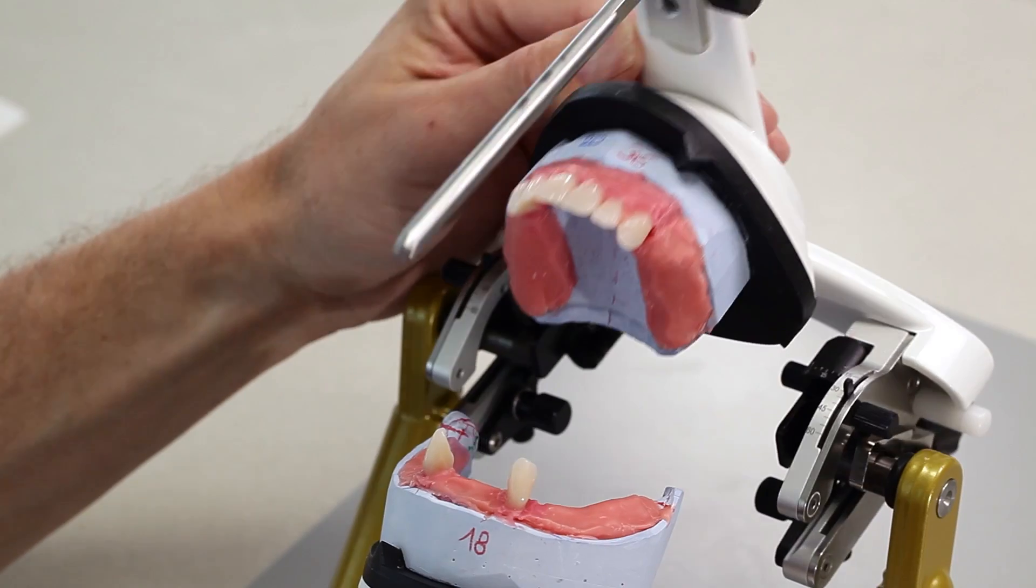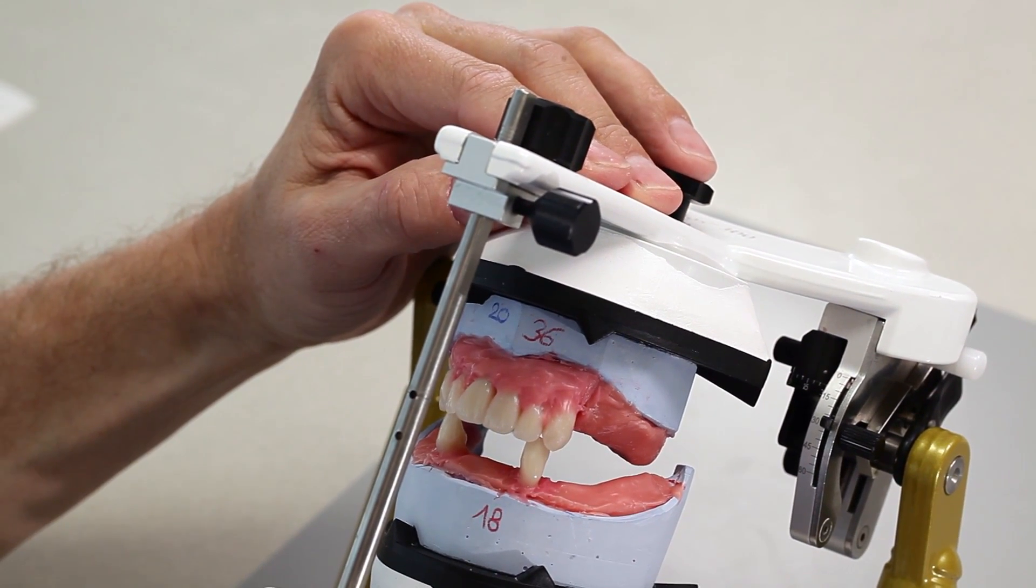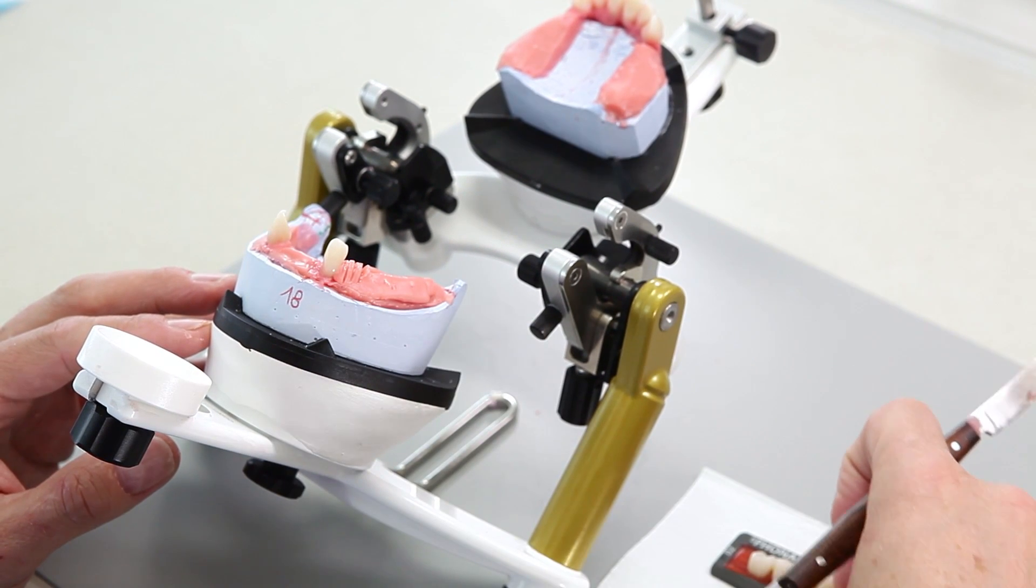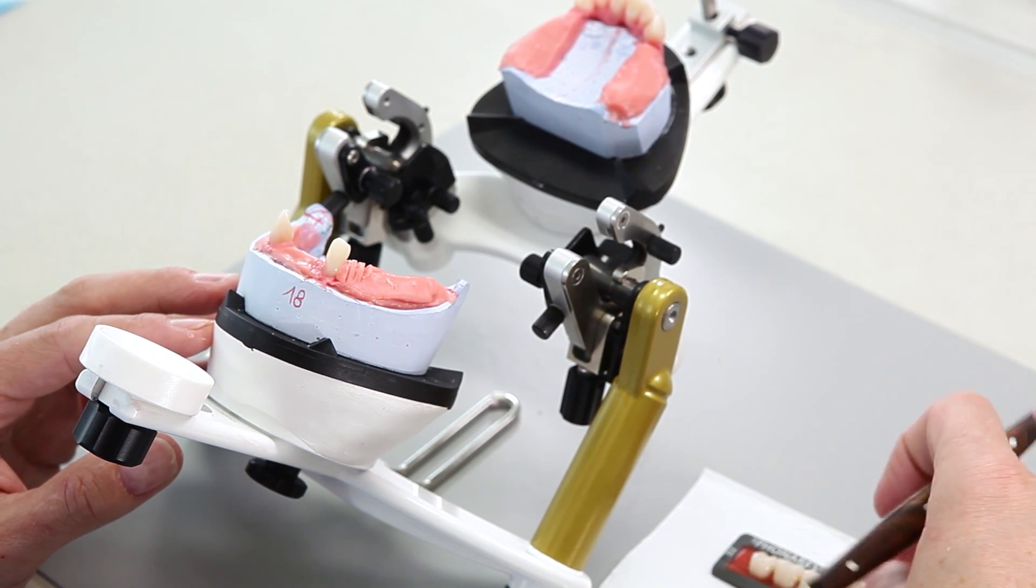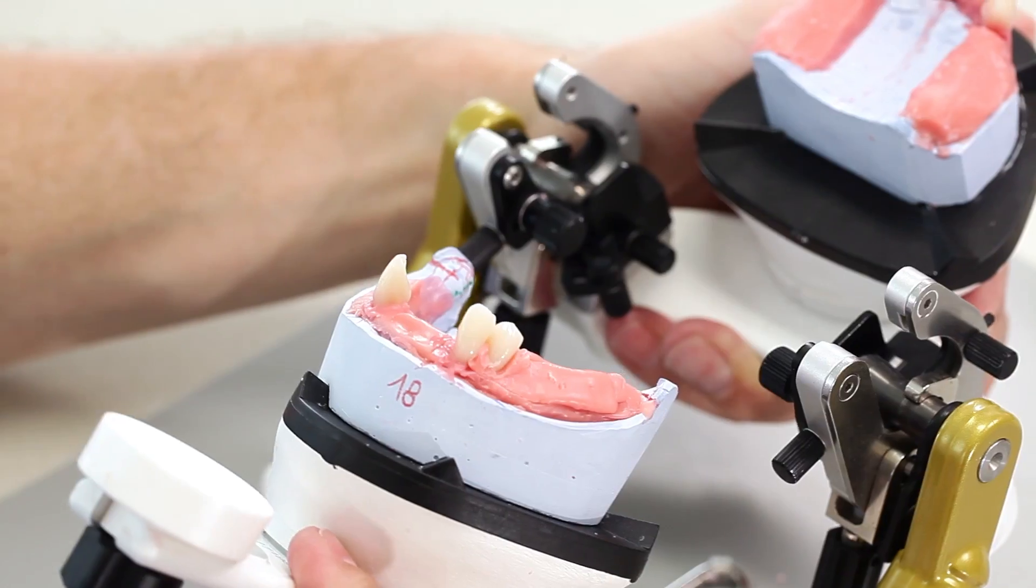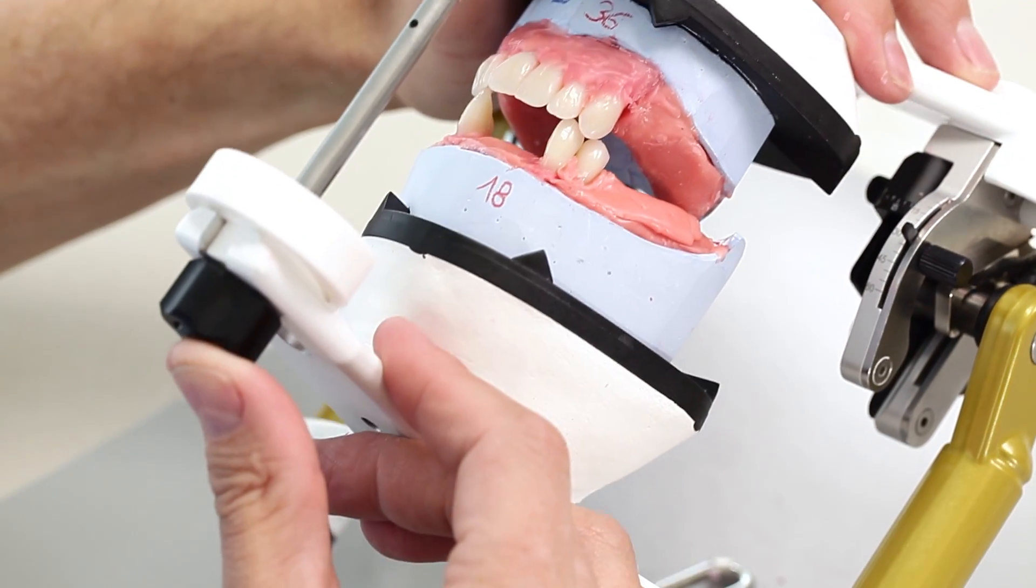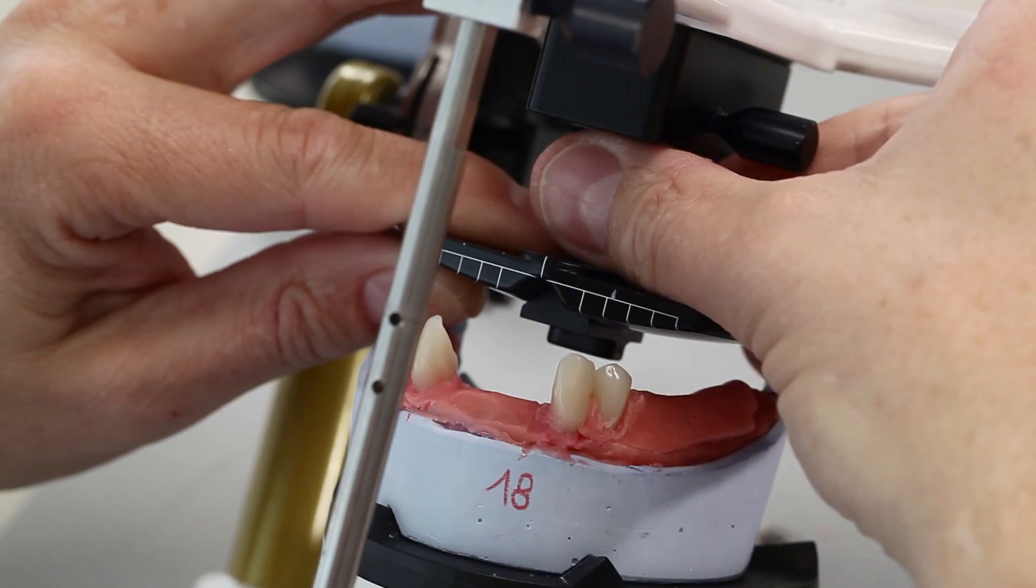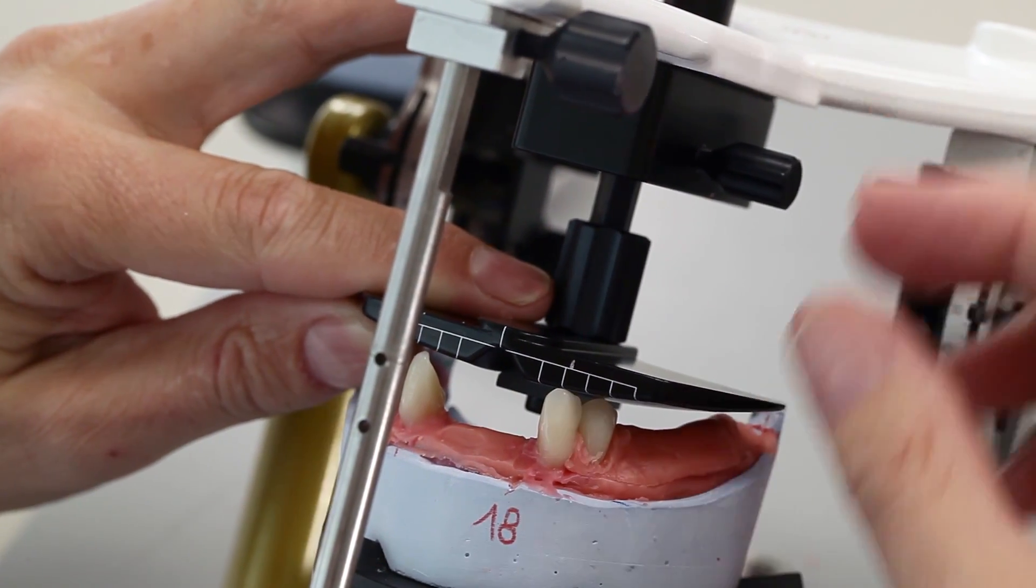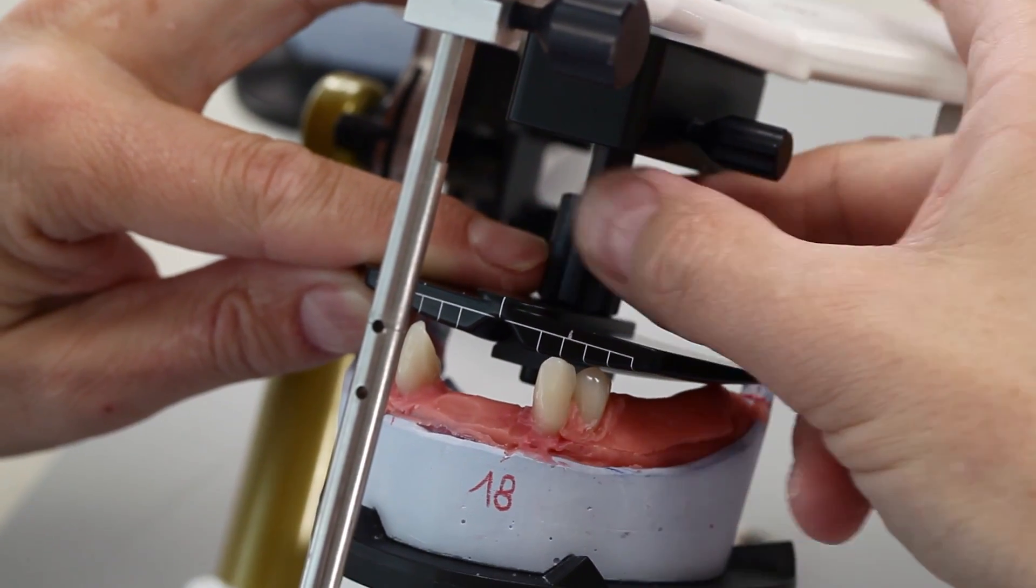It's important to set up the canine out of contact which ensures reliable group guidance in the posterior region. Position the first premolar in such a way that a smooth transition to the canine is achieved. This means that the distal slope of the incisal edge is flush with the mesial rise of the first premolar. Adjust the template for the posterior tooth setup for which the bottom side of the anterior part is aligned according to the cusp tip of the mandibular canines.